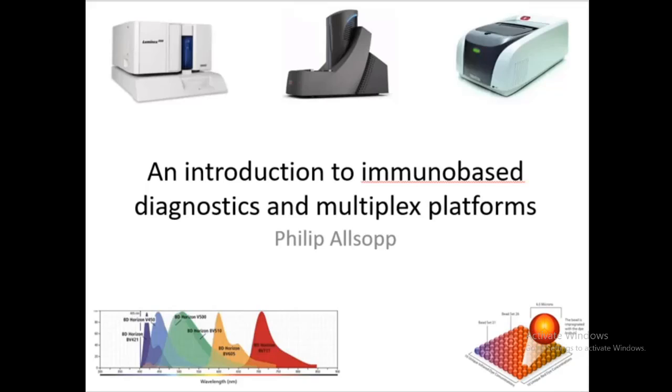We're going to be focusing on things like solid phase platforms such as ELISAs that use polystyrene plates and other types of solid matrices. We're also going to talk a little bit about fluidic-based platforms that involve quantification of a target in a liquid stream. And that'll be focusing on the Luminex platform, which we'll talk about a little bit later.